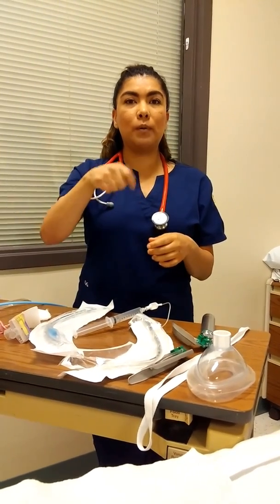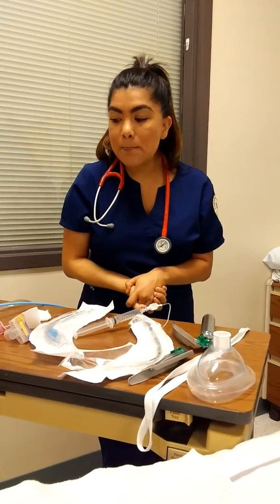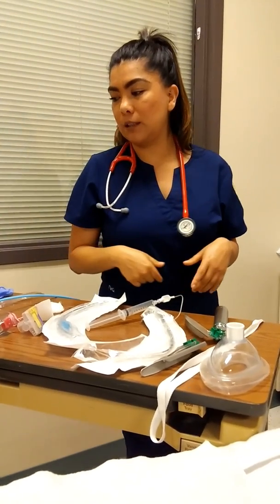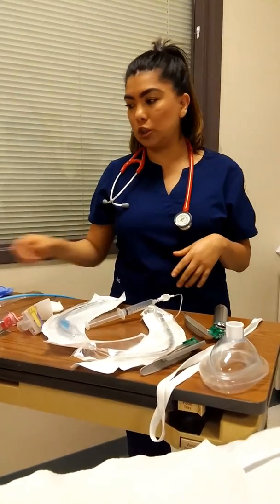A blind technique would be if you do not have the Magill forceps and you need to insert the endotracheal tube through the nose and you're just hoping that you get the airway. That's the blind technique. So then, as I've got my 3 mLs of hand sanitizer, we're going to go into the patient's room.